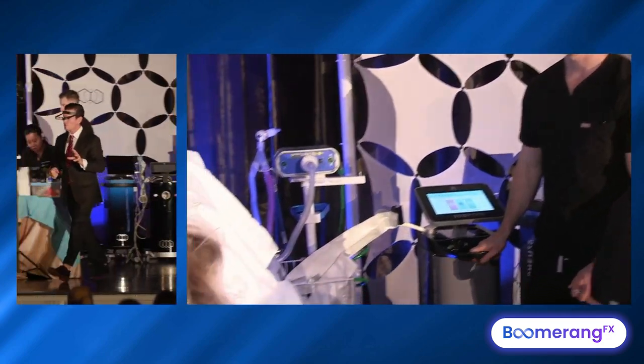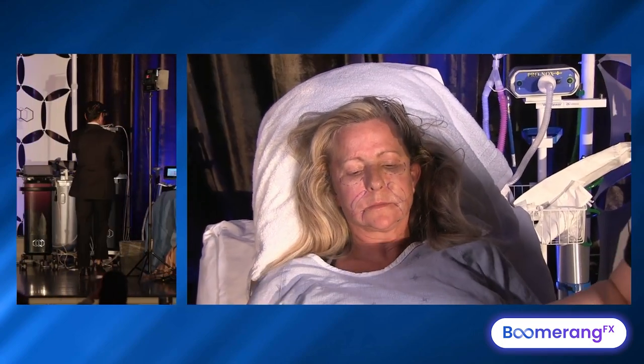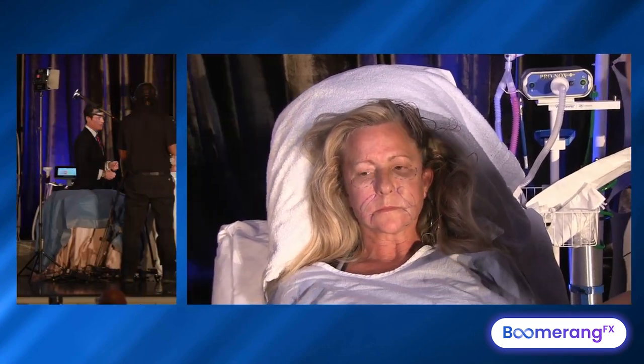I'll show you first the mesocaine technique, because you want to do this comfortably in your side office, and so I'm going to put on a pair of gloves.